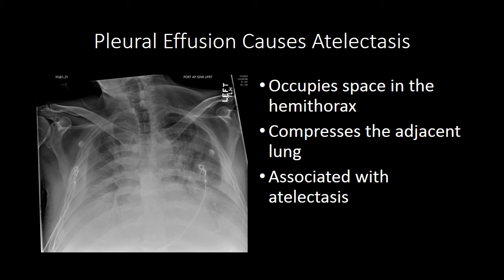Pleural effusion is a very common reason to have atelectasis, and there is almost always atelectasis in the setting of a pleural effusion. The pleural effusion occupies space within the hemithorax, which is relatively fixed, compressing the adjacent lung. In this case, we see the meniscal sign with the space along the pleura thickened by fluid, and underlying those effusions are very dense opacities that are really a combination of the effusion and the atelectasis.